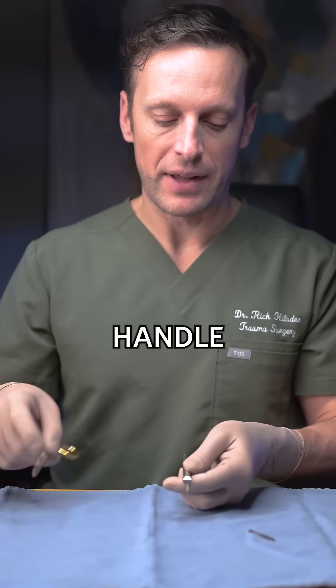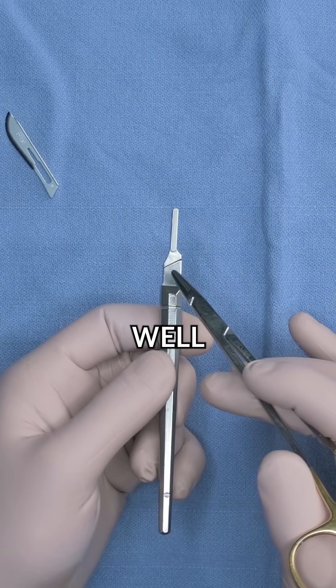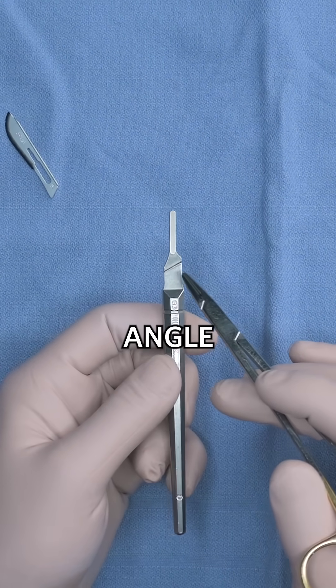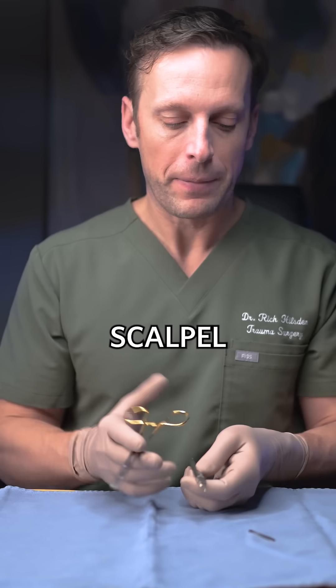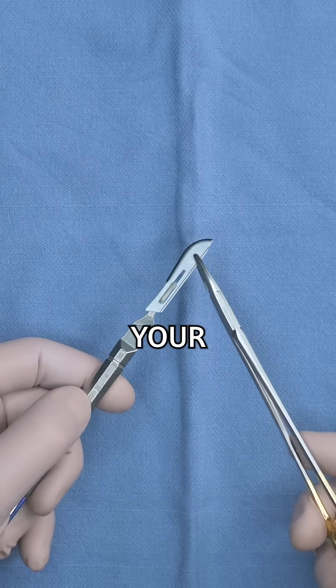First you want to take a look at your scalpel handle and identify the fenestrated groove here, as well as the angle on the shaft of the scalpel. This will match up with the keyhole on your blade.